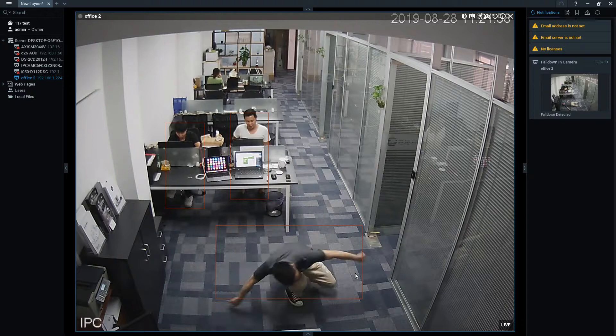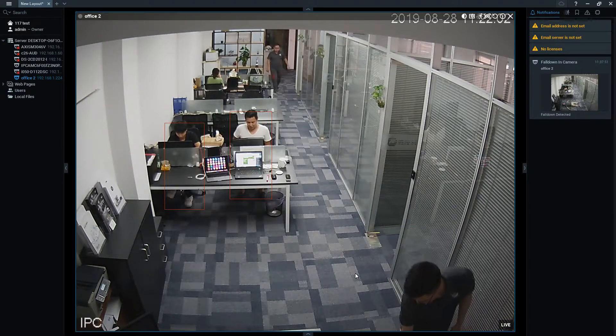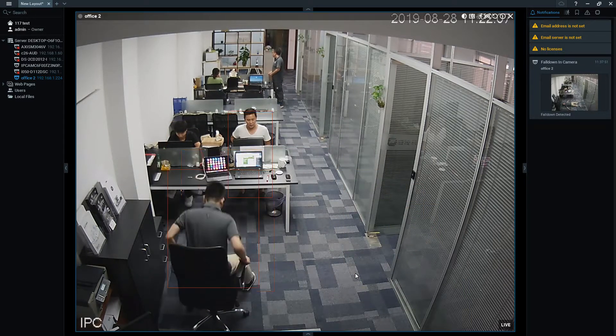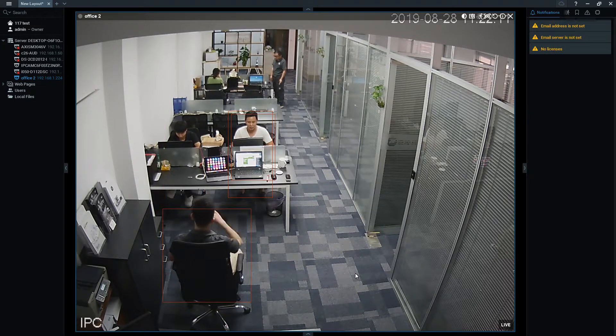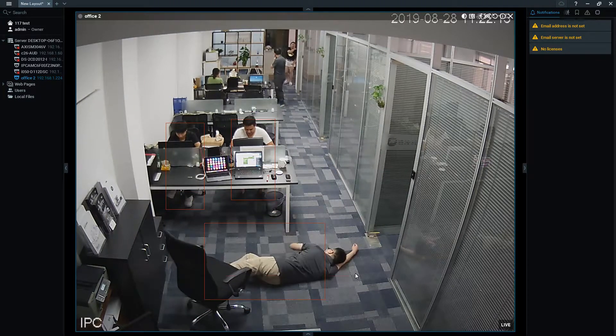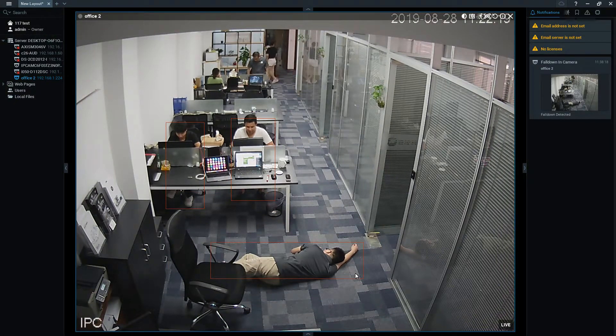Now we are going to do some tests on the chair — we can mimic the situation. If there is a patient sitting on the chair and he falls down, what is going to happen? Someone is sitting on the chair and falls down, and the alarm pops up on the right. Fall is detected.